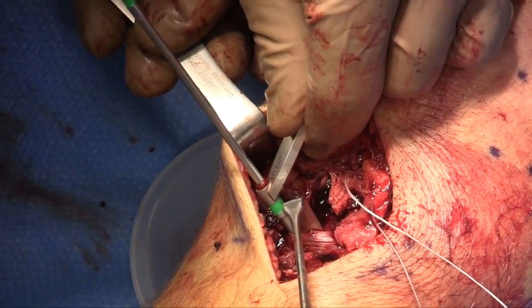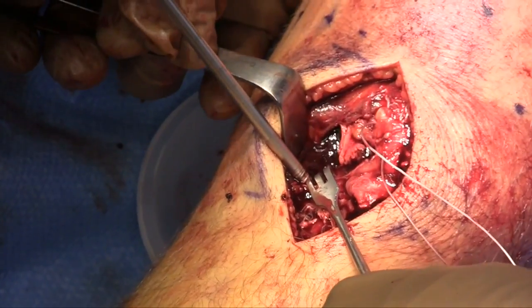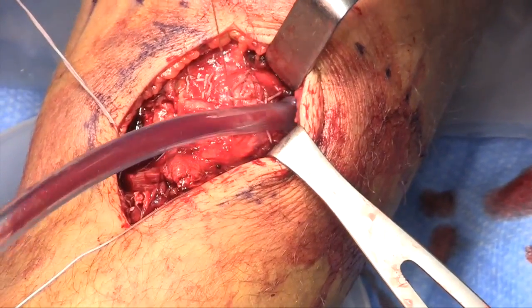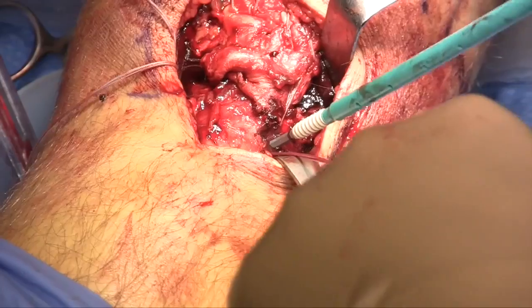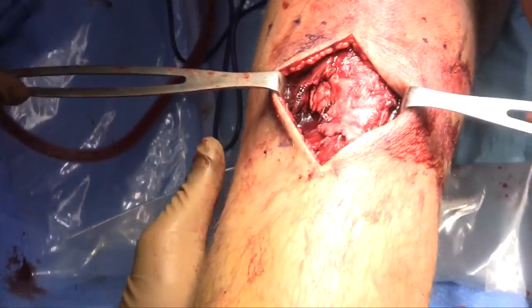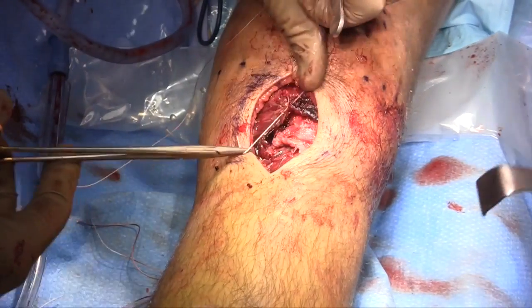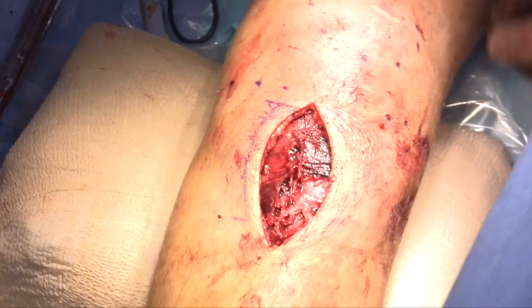To provide additional distal fixation, No. 2 high-strength suture material was passed in Krackow fashion through the distal 1.5 cm of the patellar tendon on its medial side and fixed to the tibial metaphysis using a suture anchor. This was repeated on the lateral side, similarly passing No. 2 high-strength suture through the distal 1.5 cm of the patellar tendon and fixed to the tibial metaphysis using a second suture anchor. The free suture ends were then passed through the most distal aspect of the torn patellar tendon, securing into the underlying bone. The knee was taken through a gentle range of motion, confirming secure fixation of the tibial tubercle. The wound was then thoroughly irrigated and closed in layers, starting with the paratenon layer. The skin was closed with a running subcuticular Monocryl suture and the wound covered in surgical glue.